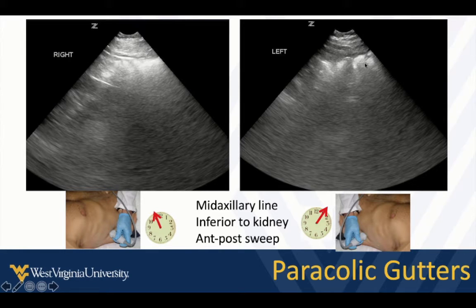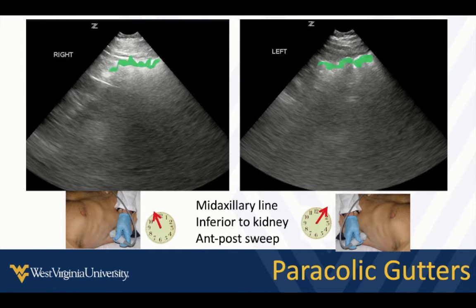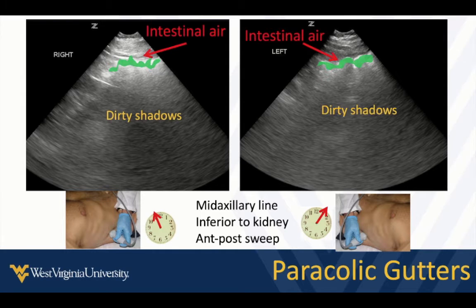These may be the first areas to fill with fluid in someone who's bleeding in their abdomen or even accumulating ascites. That's just the bowel outline, and when we see that, we know we're examining the paracolic gutter.